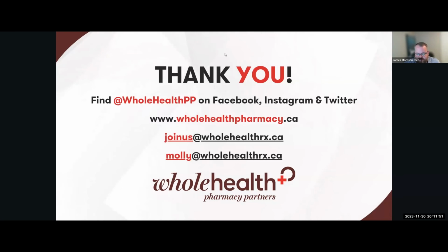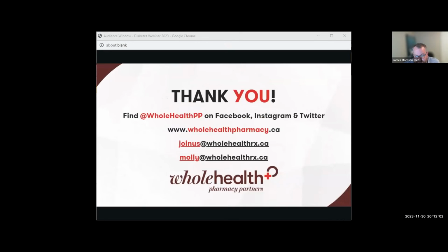The next one is from our friend Siva, and it says, "Hi Molly, thank you so much for everything so far. I use the patient view a lot, and I found that the low glucose events are really important. Sometimes I see 0% below in time in range, despite them reporting 2 to 3 low glucose events. So what you said is really helpful, and it makes sense to not forget to look at low glucose events. Thank you."